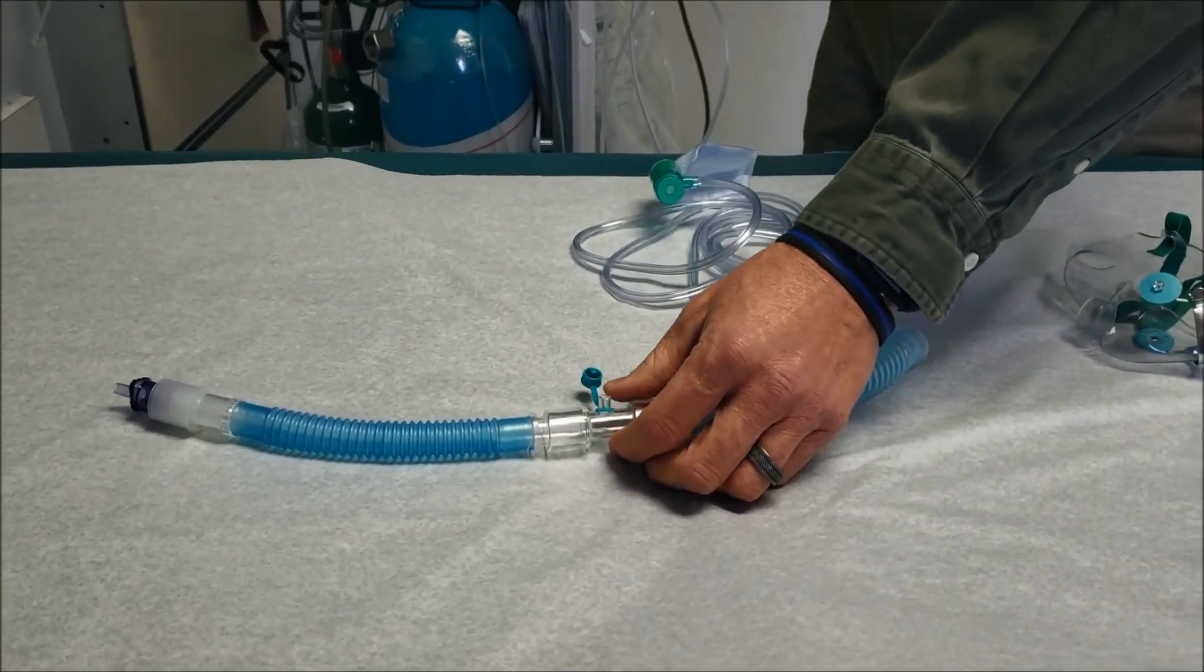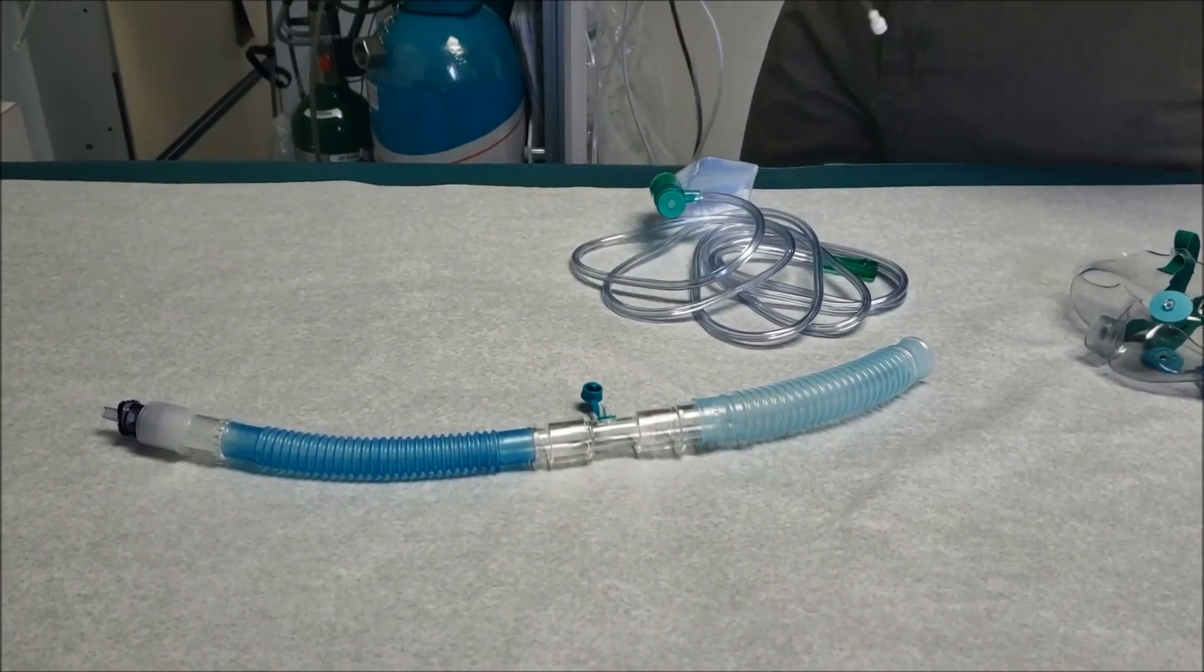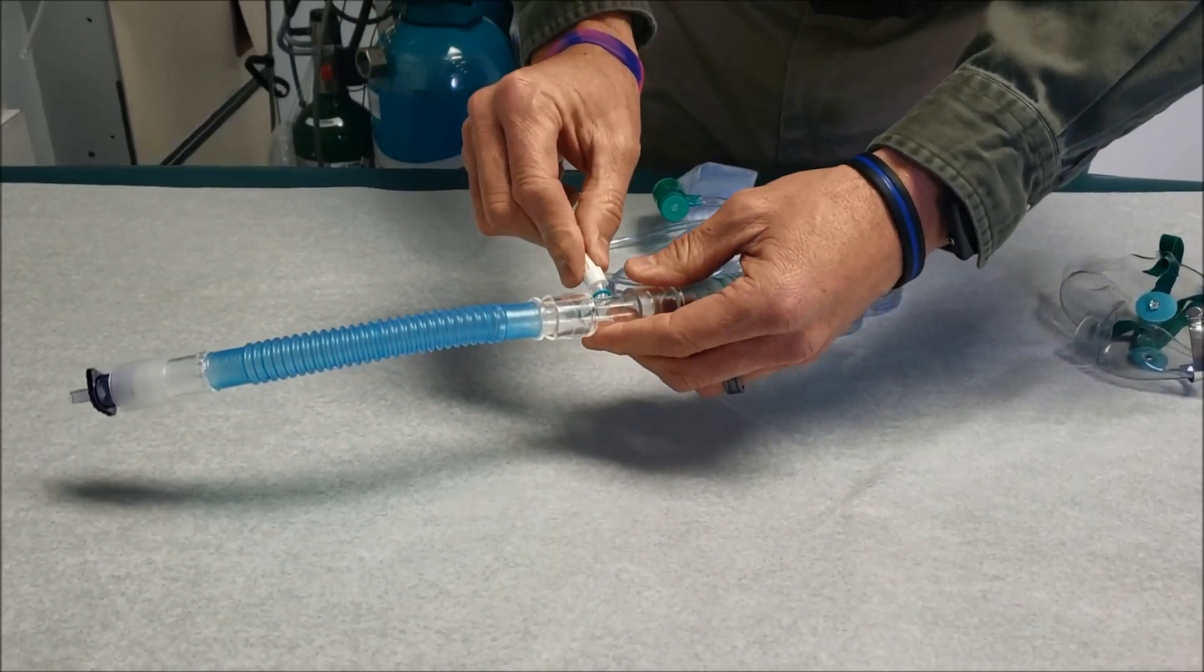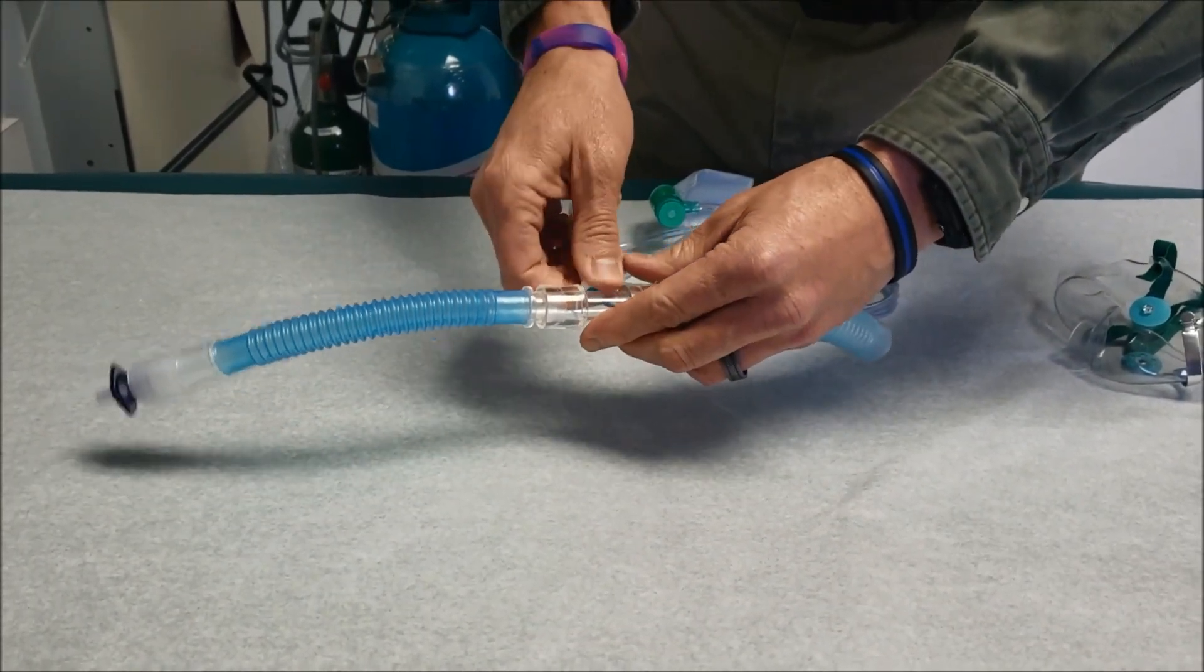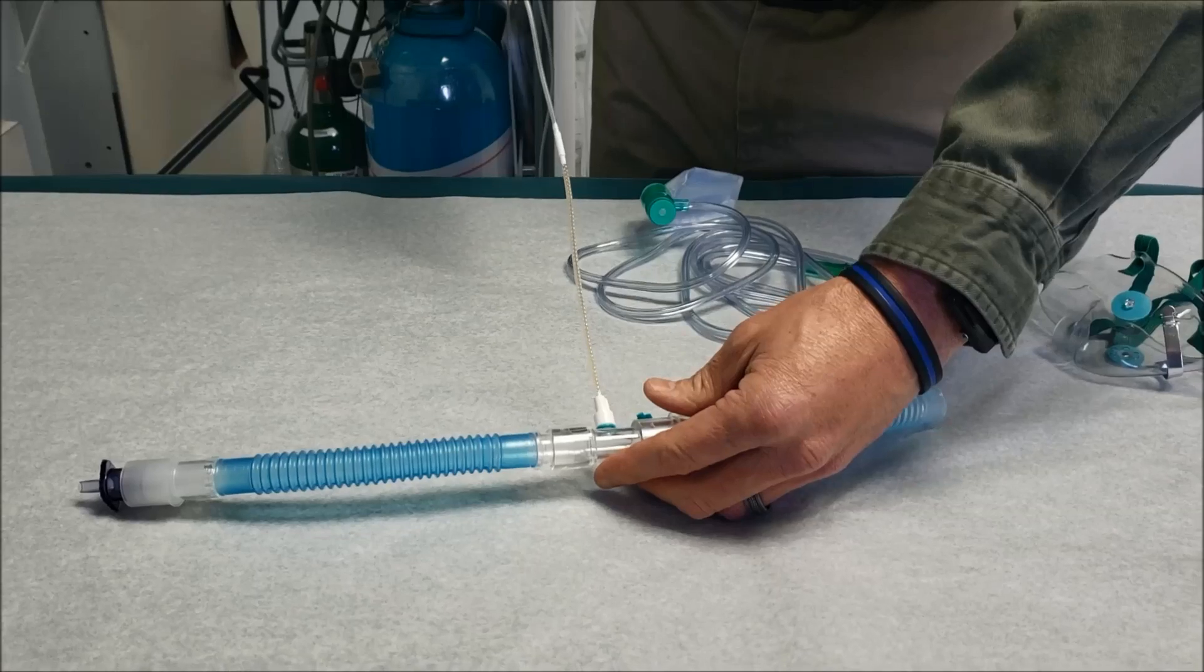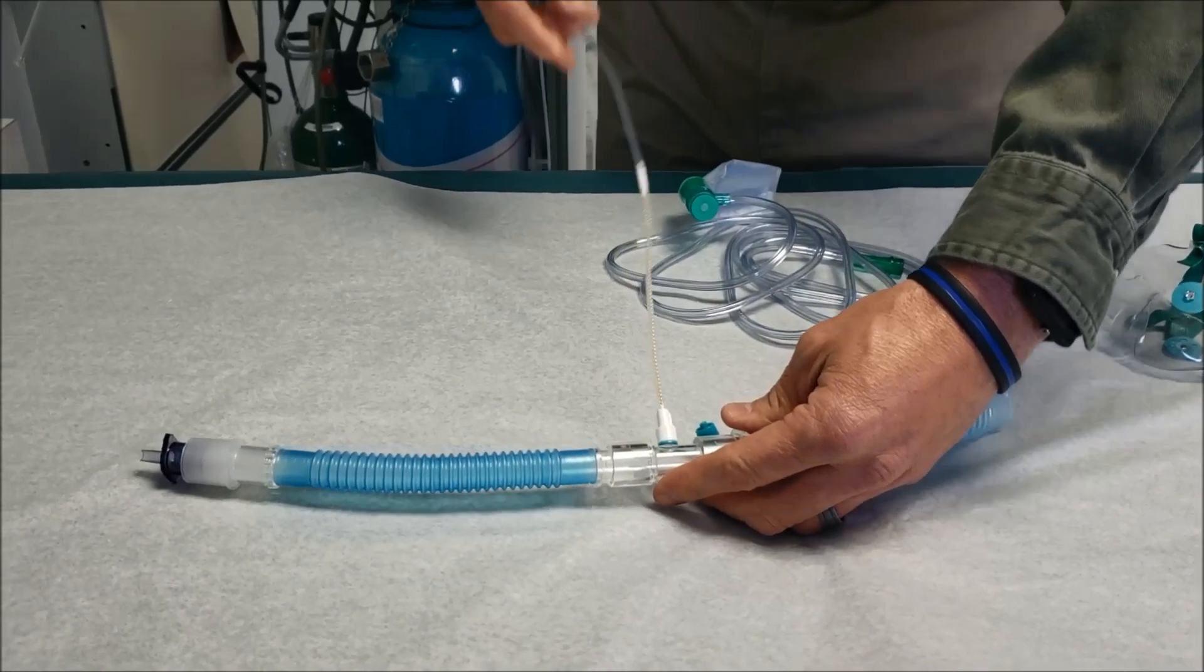This piece here is our sample line attachment. The sample line is what pulls back the sample to the machine to assure that our nitric oxide level is accurate and maintains accurate.